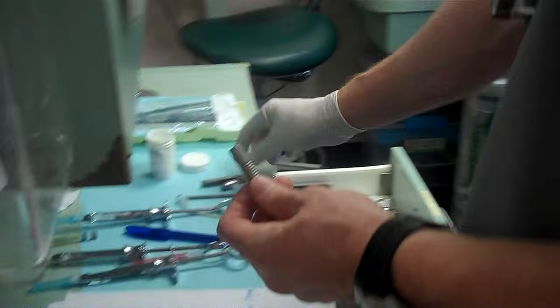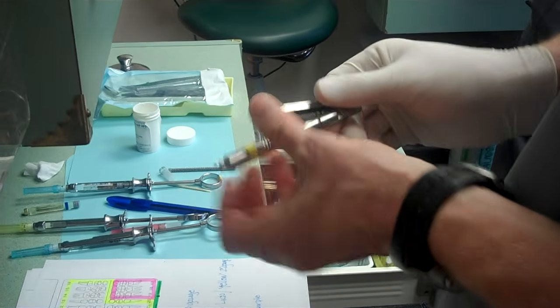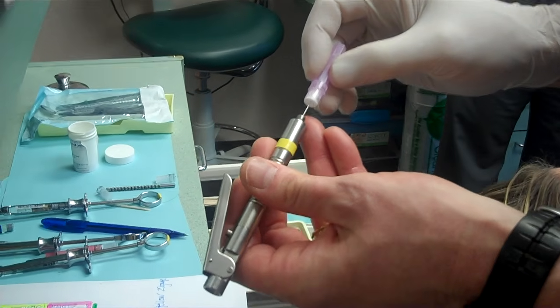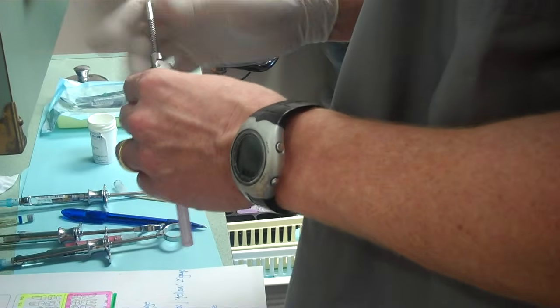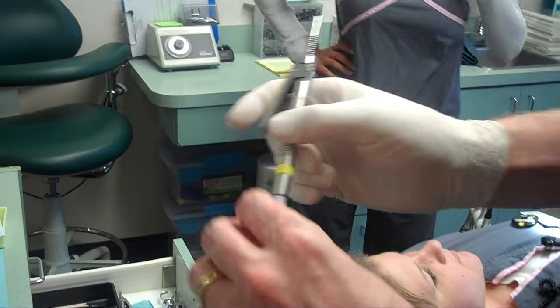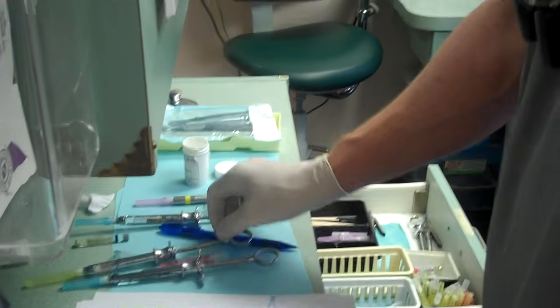I also use something called a Ligojet. We use the Ligojet with Septocaine, and we use it in cases where we have a hot tooth that doesn't get numb as easily as it should. This is pressure anesthesia, and we use the purple needle with that. Good for lower molars, good for endodontic teeth that don't get numb, and it's a pressure-based anesthetic with a short tip like that. All you have to do is load it up like that. I almost never use it for uppers, use it mostly for lowers.